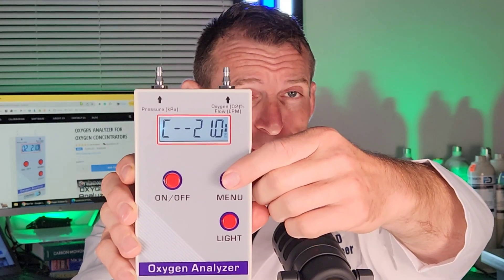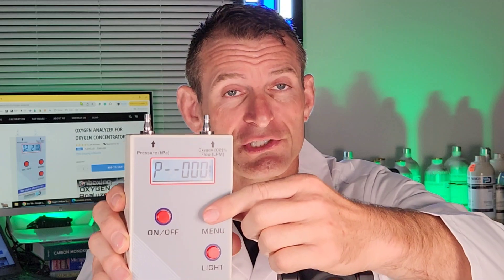Press the menu button and it gives you the flow — it determines the flow rate of your oxygen machine. Press menu one more time and it gives you the pressure output of your oxygen machine. Click it again and it gives you both values simultaneously: the oxygen concentration with the flow. It's a very versatile unit, especially for technicians and technically minded people.